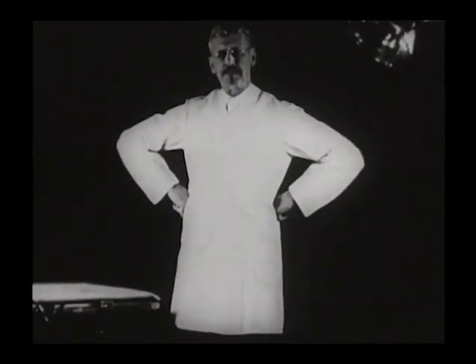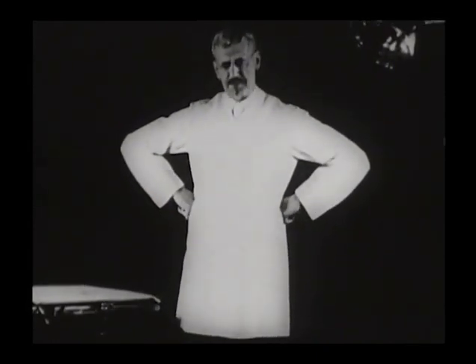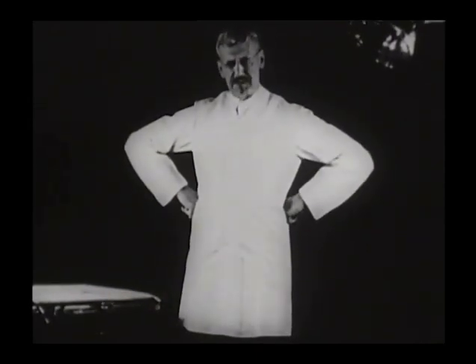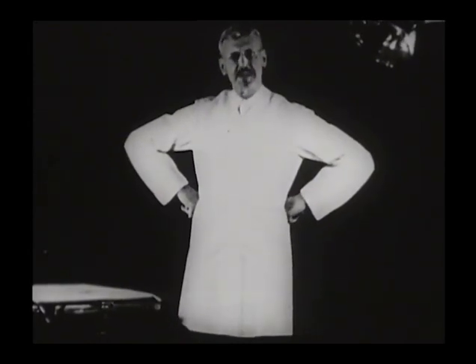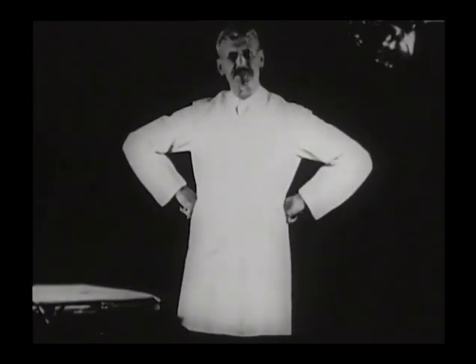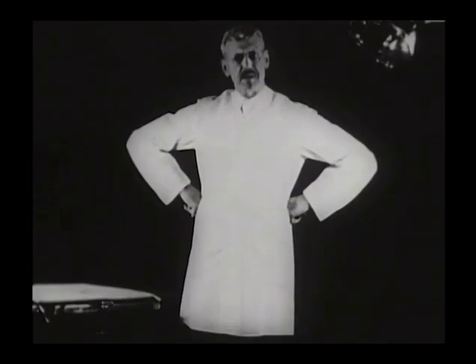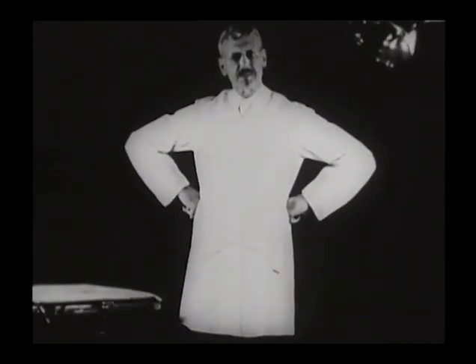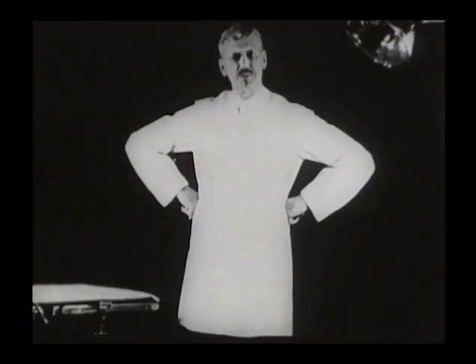Now, gentlemen, do not fear the difficulties that you might encounter. The field is open before you, and you can meet the emergencies as they arise. The hemorrhage you can control by the ordinary proved surgical method, and mechanical difficulties are overcome by taking time and by art instead of strength. Let me again recommend the low cervical cesarean or laparotrachelotomy as well as local anesthesia. Any of the difficulties an ordinarily skilled surgeon can overcome. And if you will perform this operation as a routine, I am sure that you will cut your mortality in half.